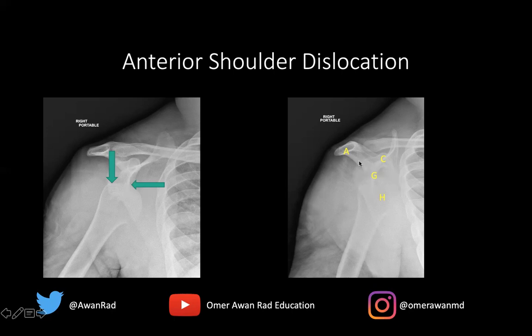On the scapular Y view — called that because the scapula looks like a Y, with the acromion and clavicle forming the two prongs and the scapular body as the base — the glenoid is this circle. The humeral head should be superimposed on the glenoid normally. But if the humeral head is under the coracoid, that indicates an anterior dislocation because the coracoid process is an anterior structure. If the humeral head were sitting under the acromion, that would be a posterior dislocation, since the acromion is a posterior structure.